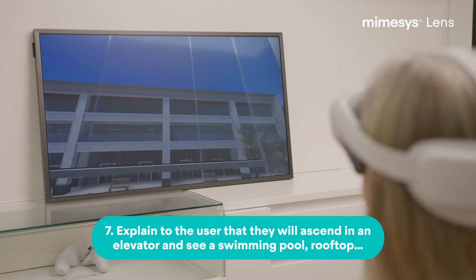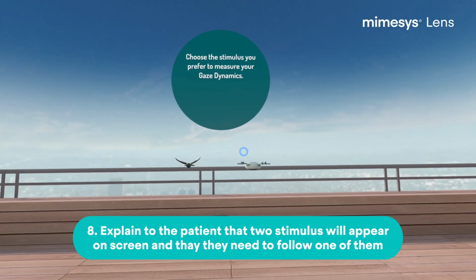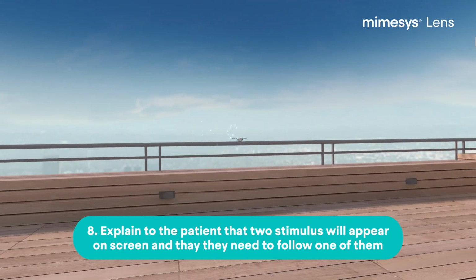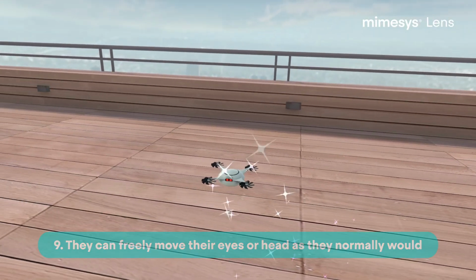Explain to the patient what they are seeing on screen. 2 stimuli will appear in the central panel. They must choose one of them and follow the stimulus as they would in the real world. They can freely move their eyes or head as they normally would.